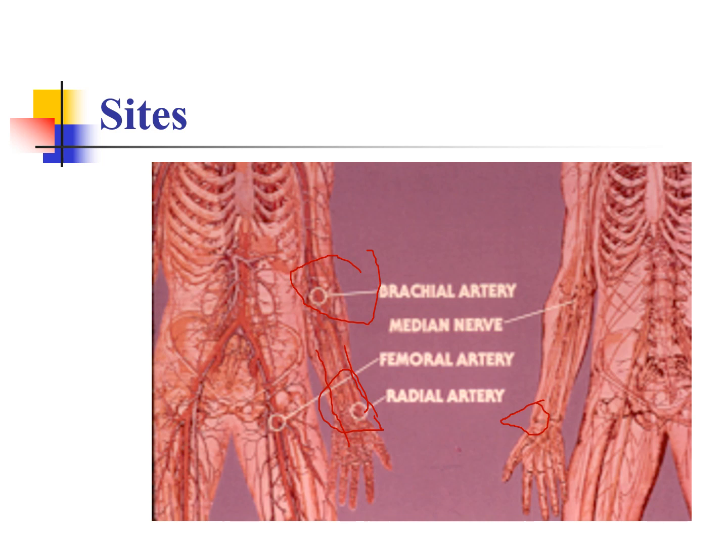Your final site is going to be the femoral, and I wish I could give you guys my whole thing. So if you know the hook 'em horn sign, where you have your pointing finger and your pinky finger stick out, and you put your two middle fingers, so your ring finger and your middle finger, bend them down. So that's about the distance between the iliac crest and the femoral artery.